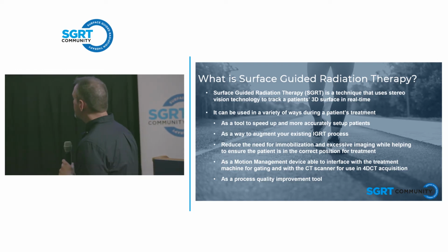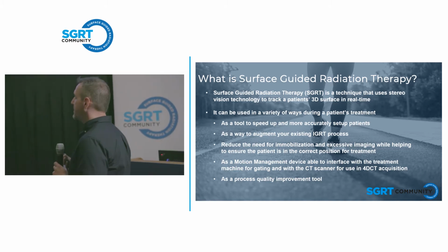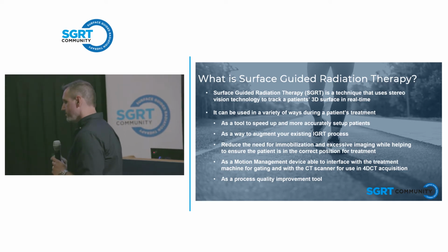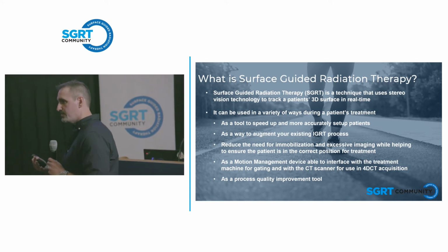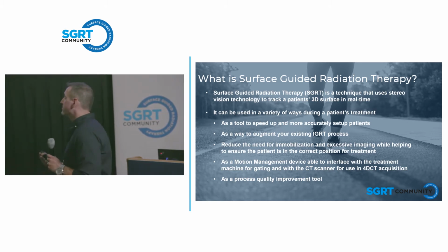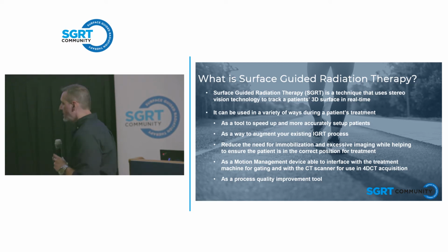What surface guided radiation therapy does for us is it gives us a technology that can be used in many different ways. It can be used as a setup tool to speed up our setups and do it in a more accurate fashion by giving us more reference points along the surface. It can be used as a way to augment our existing IGRT process, and we'll talk about that a little bit in just a minute.